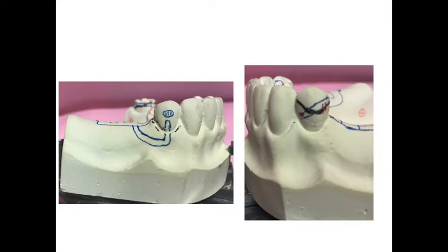It should be drawn with the blue pencil. So you see 2 different modifications. If you need to do enamelplasty, if you need to lower the survey line, there will be 2 straight red lines. If you need to add a composite, there will be a blue circle. Okay? If you mix the colors, you will still get it deducted.